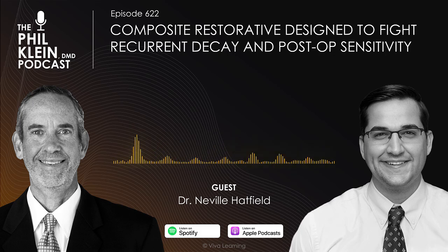Welcome to the Phil Klein Dental Podcast. Today we'll be talking about two common challenges that affect, to some degree, every general dentist that uses composite restoratives in their practice: postoperative sensitivity and recurrent decay. And to help manage these two challenges, dentists do have options in their selection of which composite resin material to use. One important thing to consider is whether your composite is bioactive. Does it actively participate in the oral ecosystem, helping to reduce post-op sensitivity and acid-producing microbes at the tooth-composite interface?